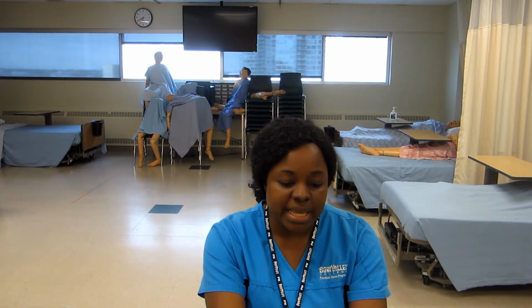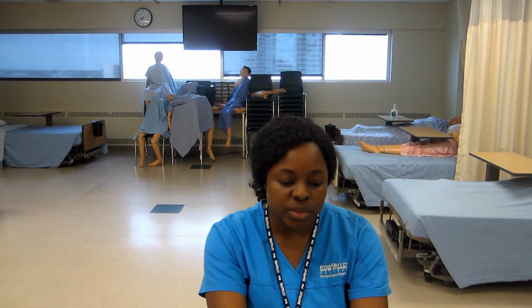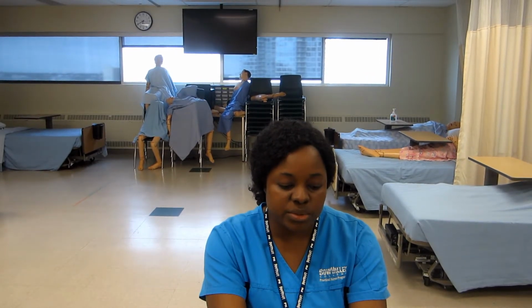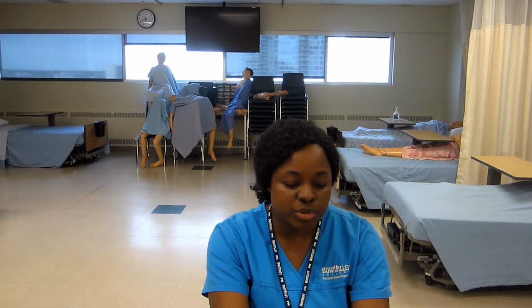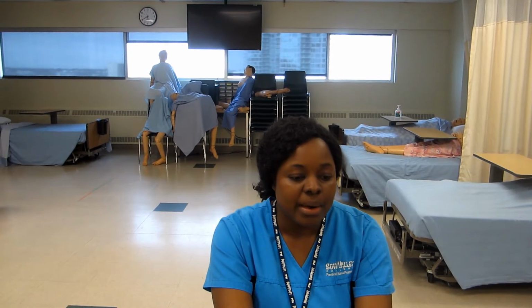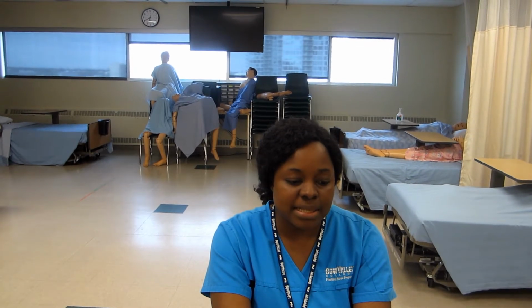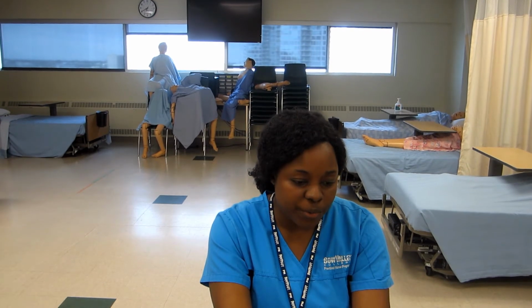The lift is then used to raise the patient off the bed and maneuver to the chair. The patient is positioned and lowered slowly into the chair. Once the patient is well positioned, remove straps and mechanical lift. Check patient's sitting alignment and correct if necessary. Perform hand hygiene and make sure you're always evaluating patient's tolerance and level of fatigue and comfort.